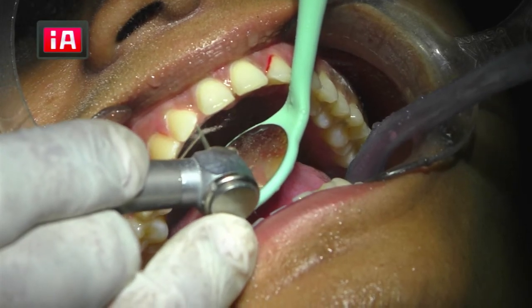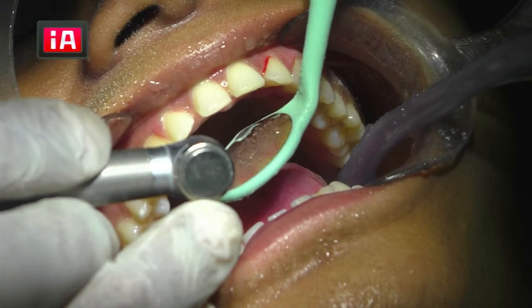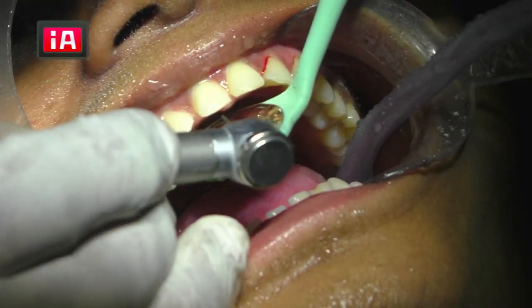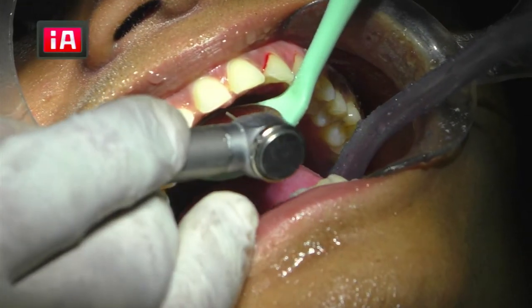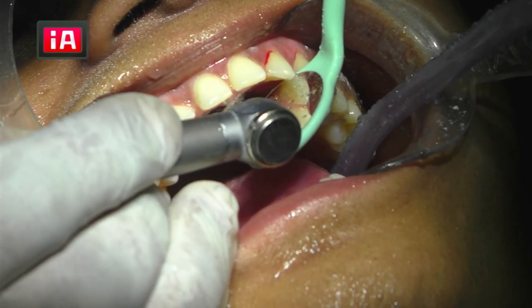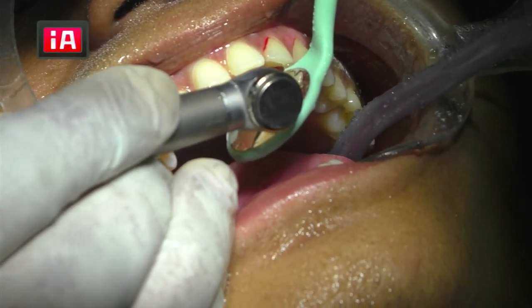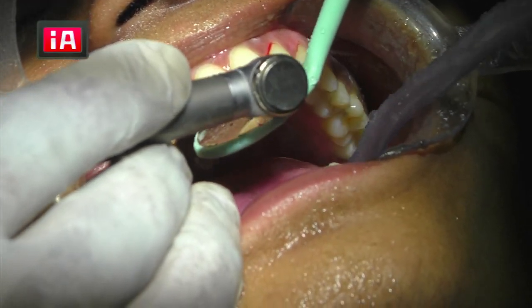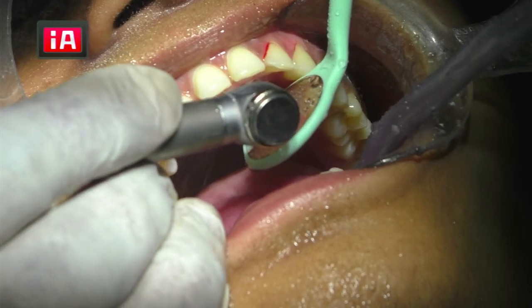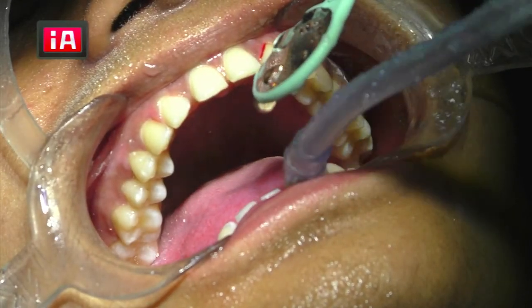Again, we'll come to the inside, the lingual. So I took a very, very thin brush, so that I can get an idea of where exactly my preparation should end lingually.